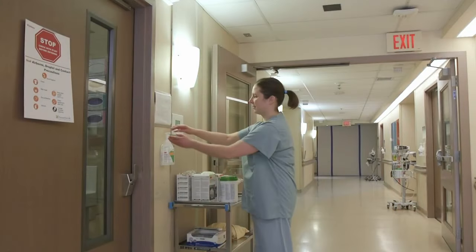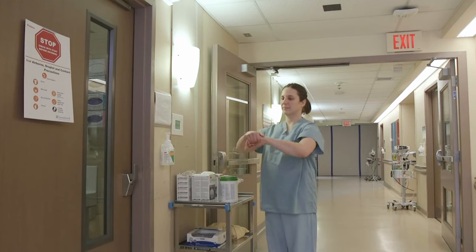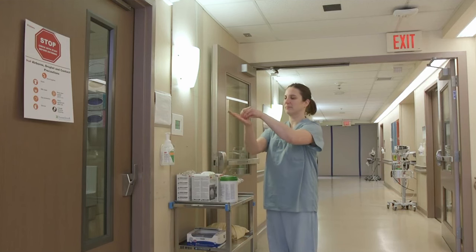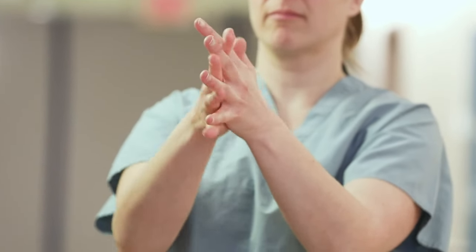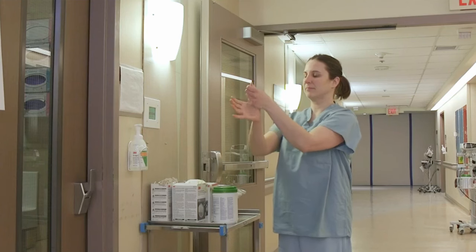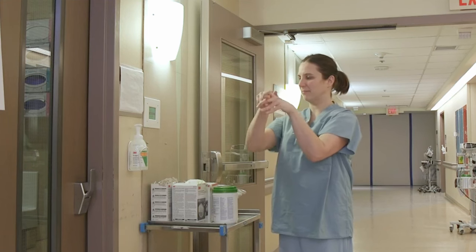When donning PPE, perform hand hygiene for 15 seconds. Apply one to two pumps of alcohol-based hand rub to the palms of dry hands. Rub hands together, rubbing palm to palm, in between and around the fingers, on the back of the hands, as well as the fingertips and nail beds. Continue rubbing until hands are completely dry. Hand hygiene using alcohol-based hand rub is the preferred method. Use soap and water only when hands are visibly soiled.